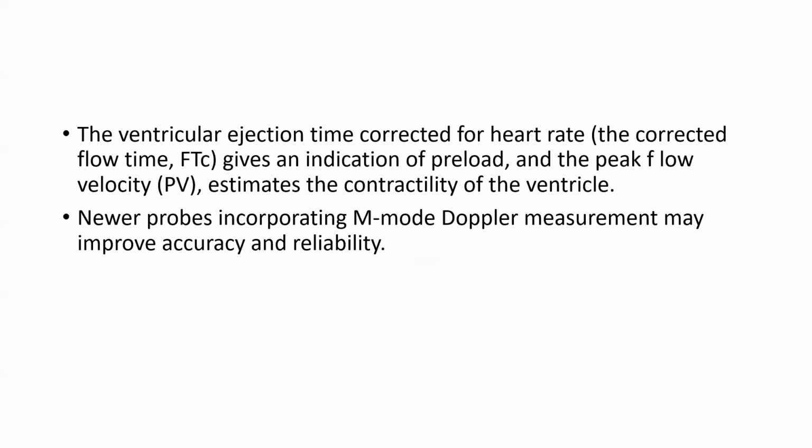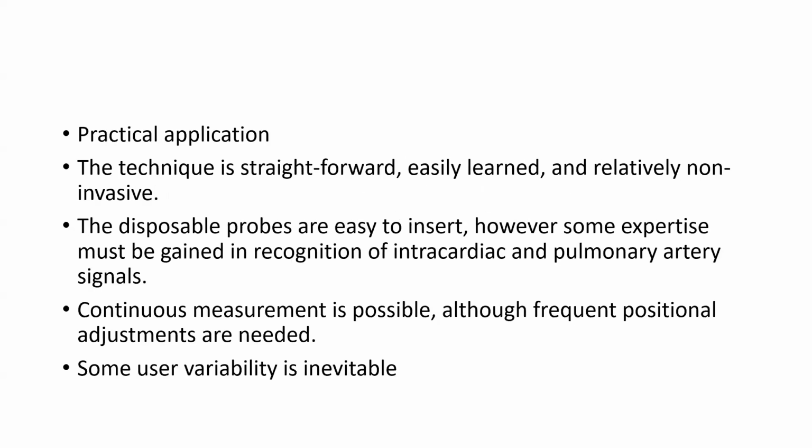A new probe incorporating M-mode Doppler measurement may improve accuracy and reliability. Now, the practical application. The technique is straightforward, easily learned, and relatively non-invasive. The disposable probes are easy to insert. However, some expertise must be gained in recognition of intracardiac and pulmonary artery signals.